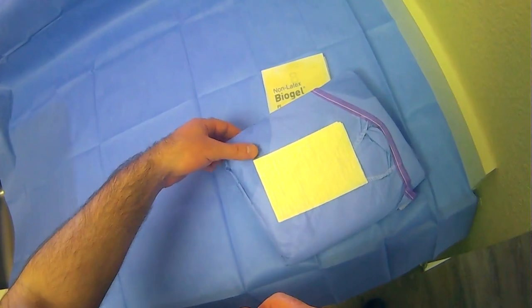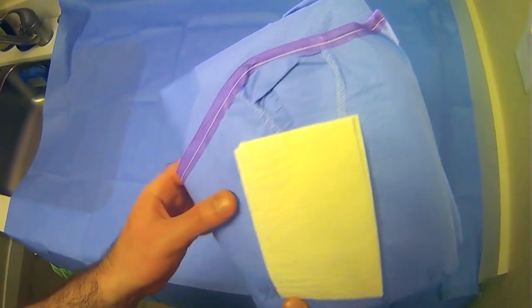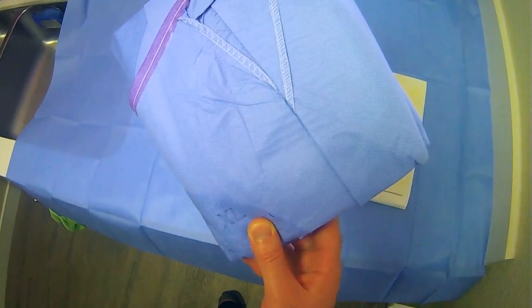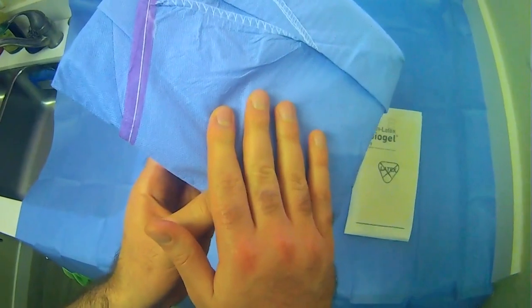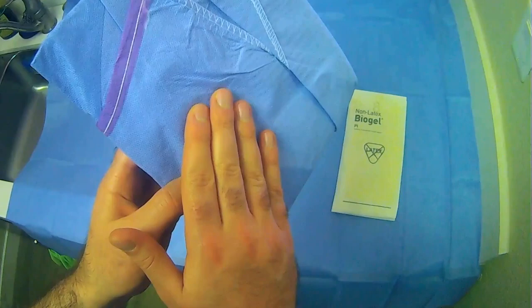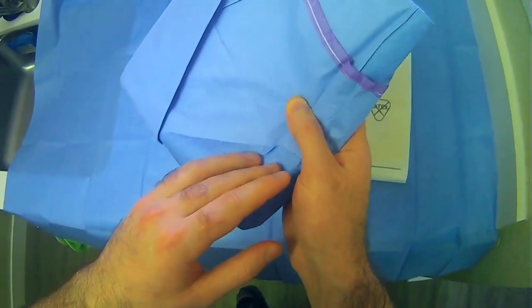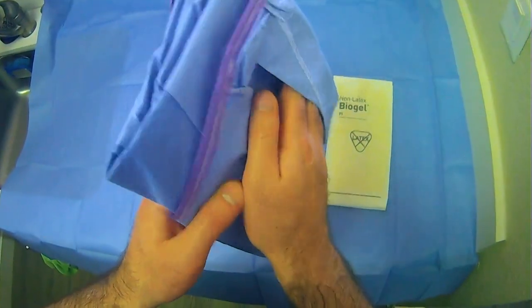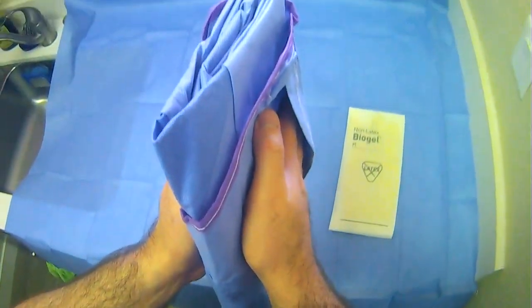gown without touching anything else, and then we'll want to grab it in the fashion here. This is just a towel, we don't need this. But what I want you to realize is that this inside of the gown is okay to grab in a non-sterile fashion, because this is going to be touching your body. And just examining the gown here, there are these little flaps on either side. This is where you're going to put your hands into when you're opening this up.